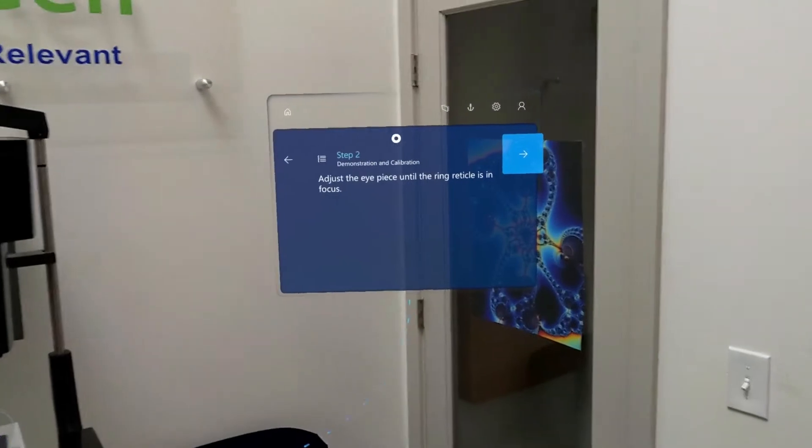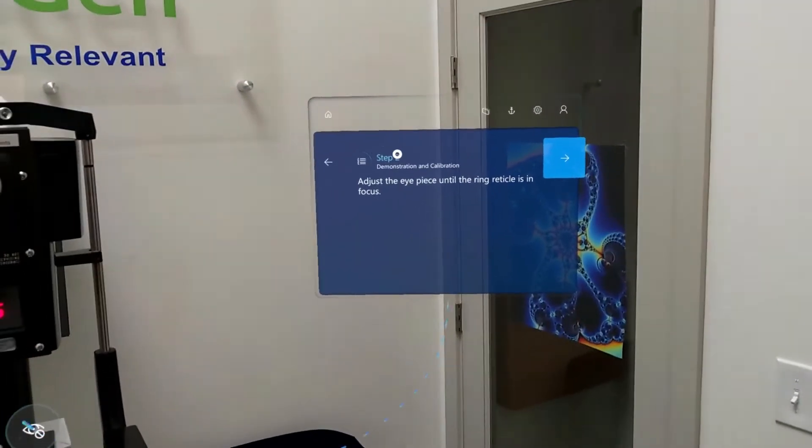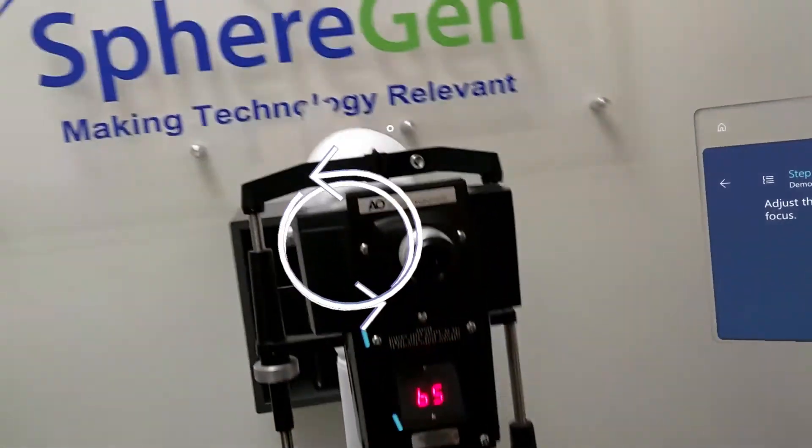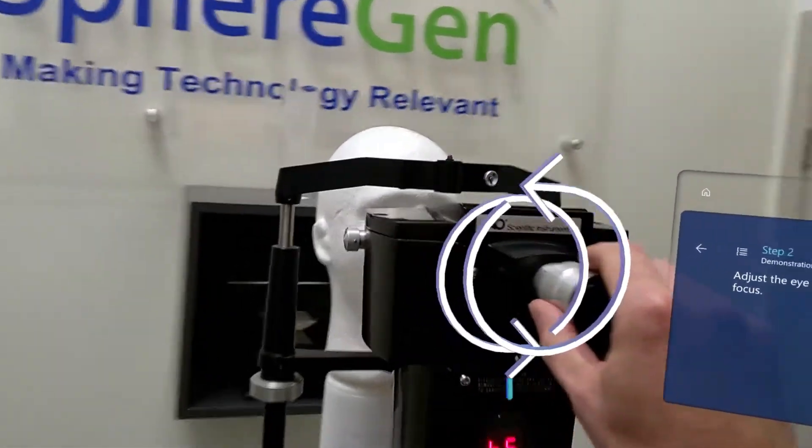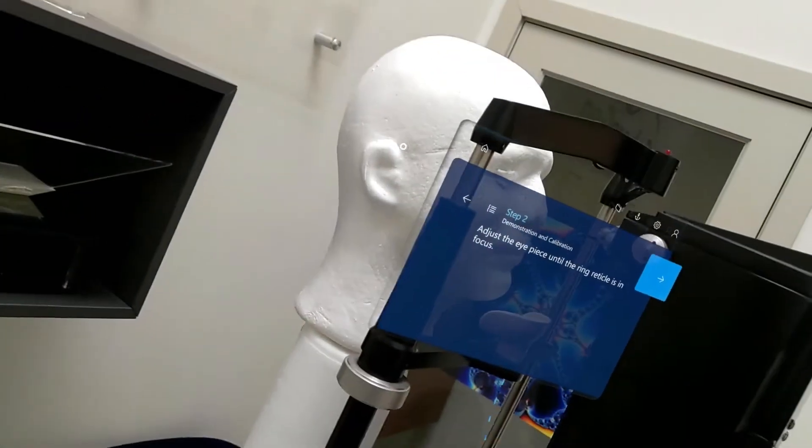Step two. We're going to adjust the eyepiece until the ring reticle is in focus. Let me show which way we can adjust — excellent.